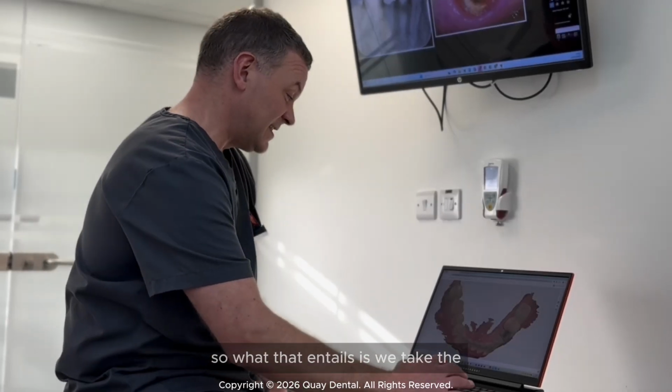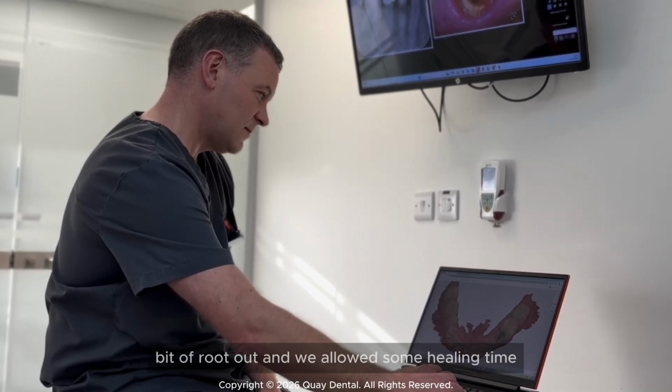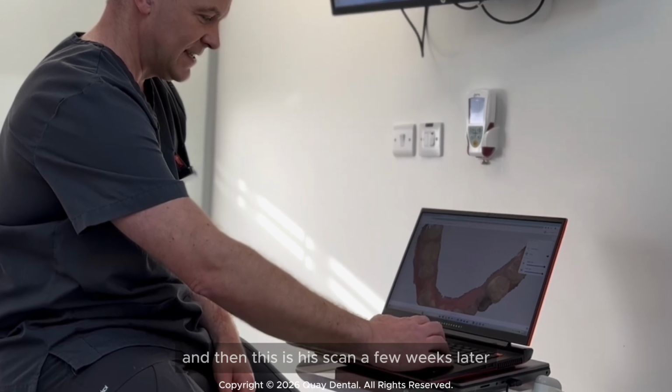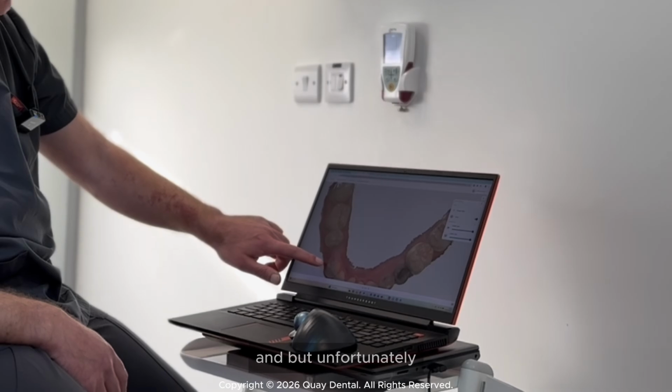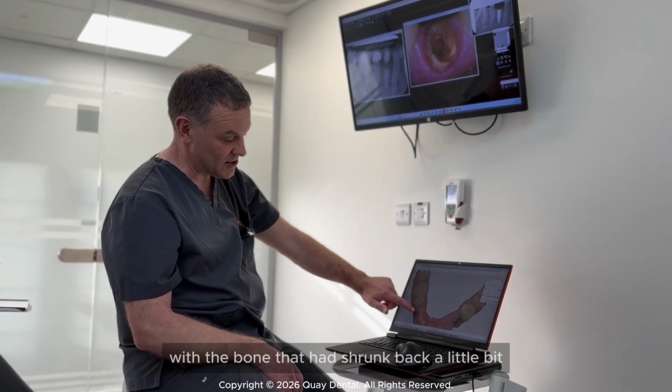So what that entails is we carefully took that little bit of root out, and we allowed some healing time, and then this is his scan a few weeks later, which shows the situation where the gum has healed nicely, but unfortunately, because of the way that the tooth had broken, there was a little defect here with the bone that had shrunk back a little bit.